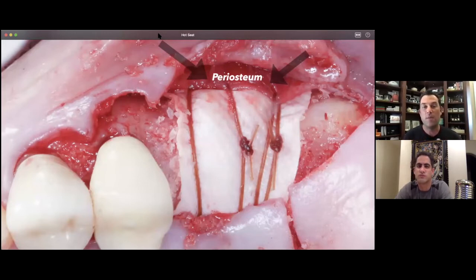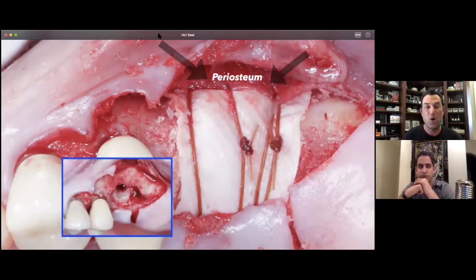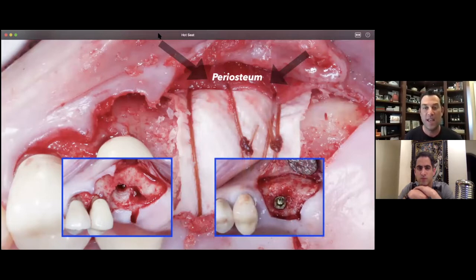Here's a great picture showing the stabilization we can achieve. Once we release the periosteum, we have almost a secondary internal flap that at its apical extent is still attached to the bone — relatively fixed — and we can use sutures with the palatal flap to anchor them and get really nice stabilization. For a case like this with a failed implant and residual threads imprinted into the palatal plate, I can stabilize over that ridge in a very easy, inexpensive, and predictable way to regenerate the buccal occlusal line angle.